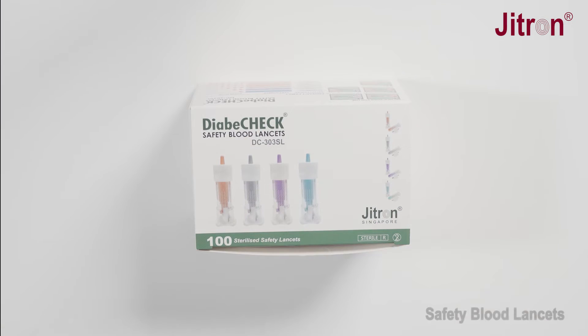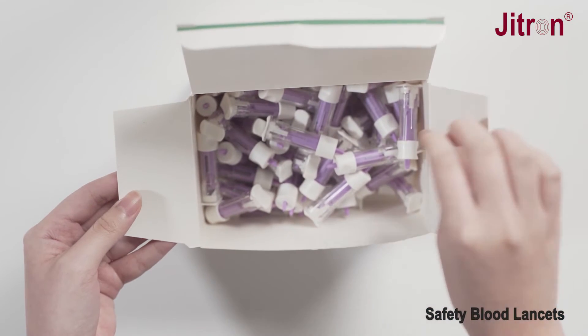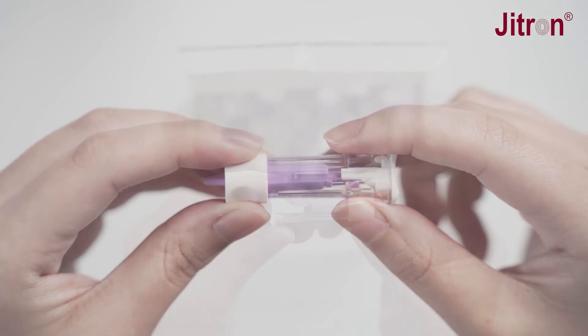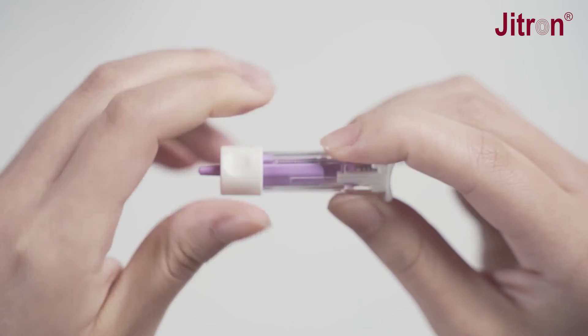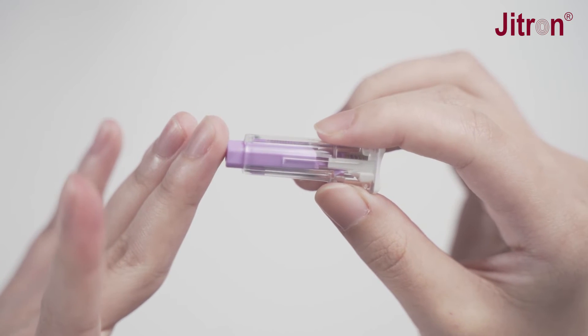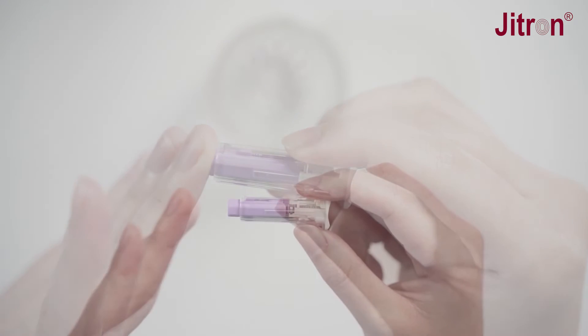Diabicheck Safety Blood Lancets DC303SL — the safety blood lancet is safe, comfortable, and easy to use. It is a pre-loaded and pressure-activated single-use sterile lancet. Simply place the lancet on the fingertip and push to get the blood sample.